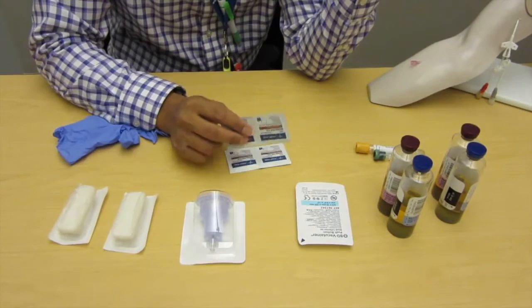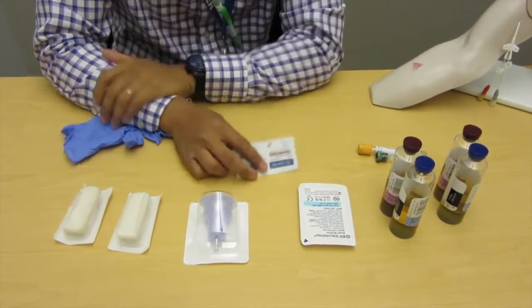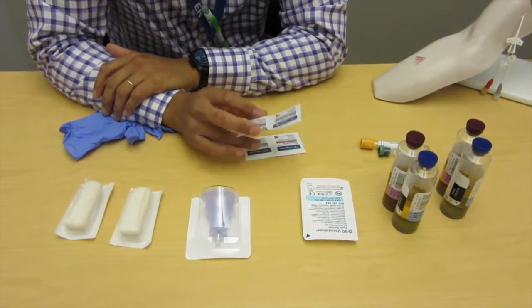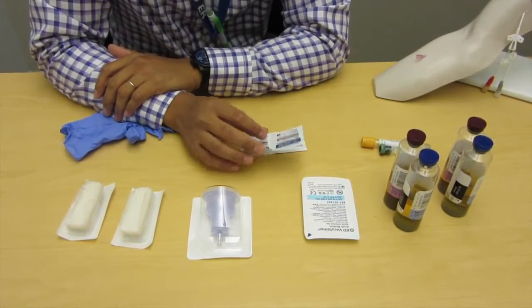Greetings, my name is Alan Bolda with Josh Burke from Kaiser Oakland and Kaiser Richmond. What I'm going to demonstrate for you today is how to properly draw blood cultures.